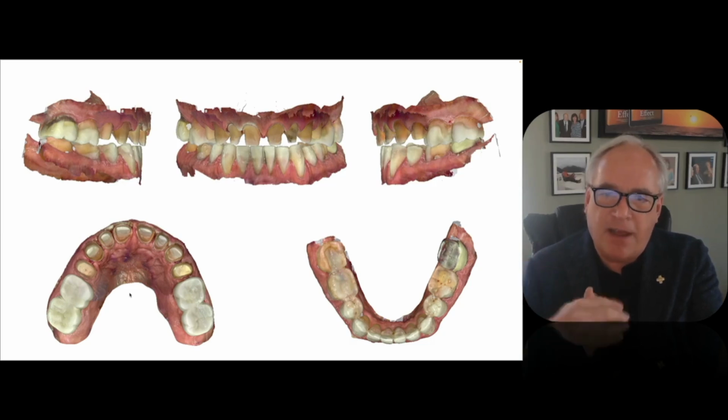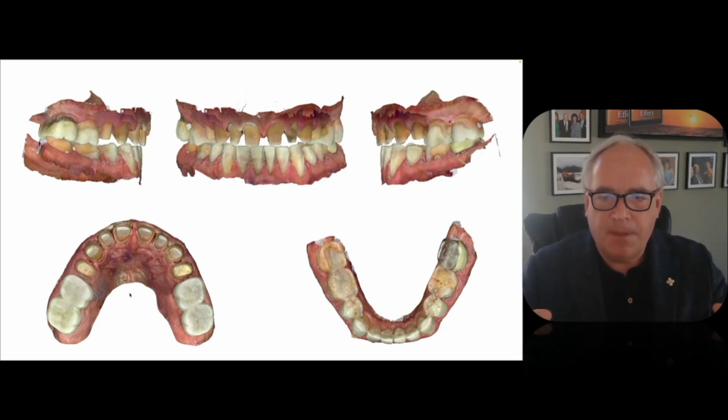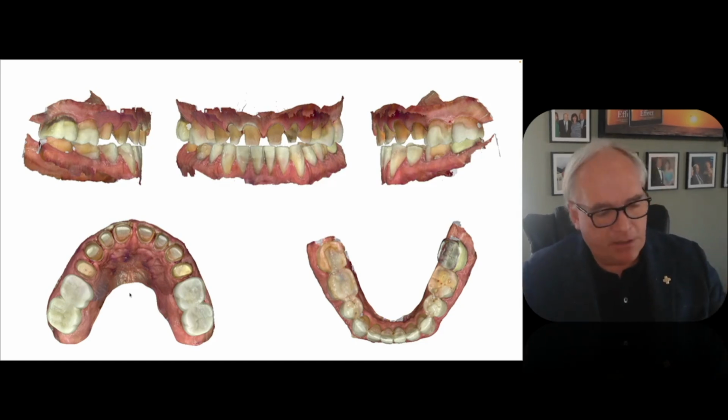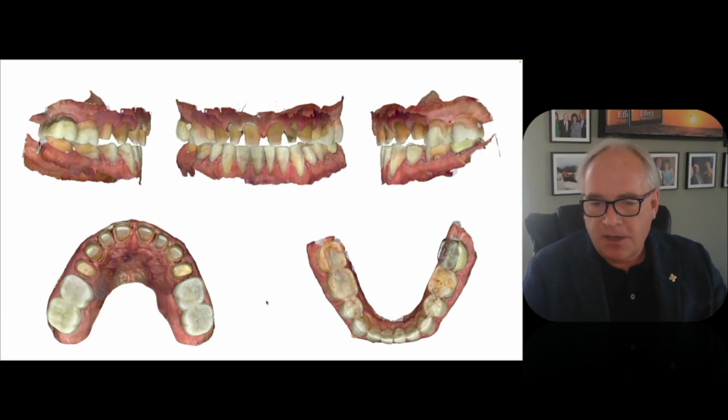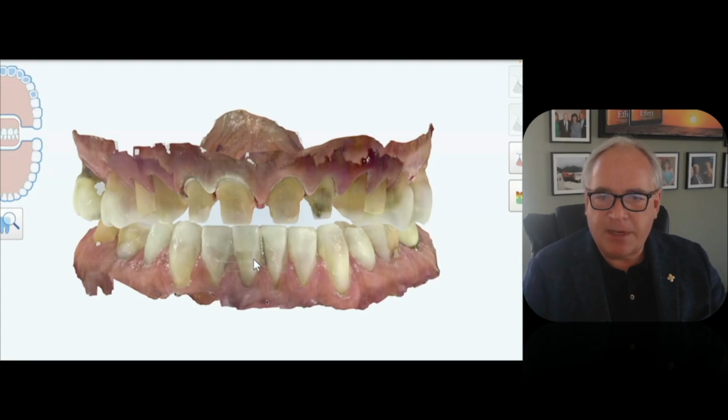And he sends the file back to us, an STL file of the printed. It's like the wax up, but it fits the teeth, and then we just print it. So in about an hour, while I'm packing tissue and doing our final scans, we can have a provisional printed that is going to have perfect fit with the margins and be really strong because it's a resin ceramic material. But anyway, here are the scans.